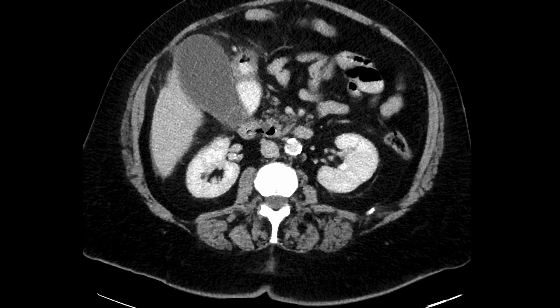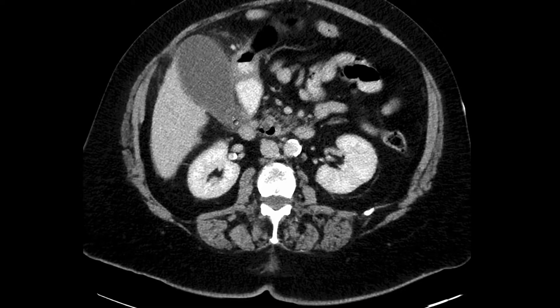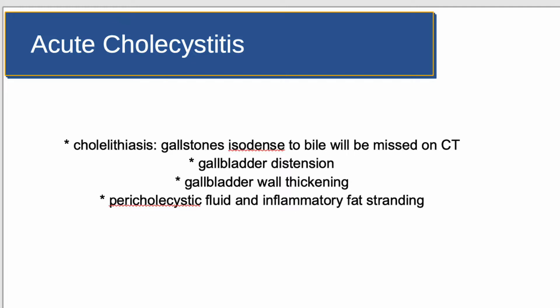In this case, we have multiple findings that lead to the conclusion that this patient has acute cholecystitis: number one, cholelithiasis; number two, distension of the gallbladder; number three, gallbladder wall thickening; and number four, pericholecystic inflammatory fat stranding.